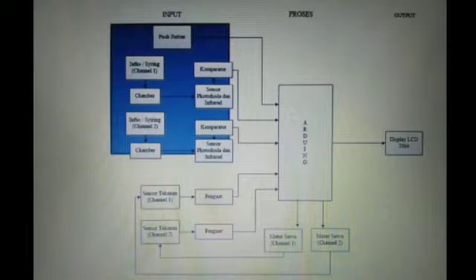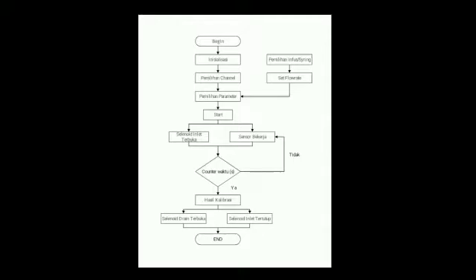The output of the photodiode and infrared will enter the comparator circuit and compare the input voltage with the reference voltage. Then the ADC will change the analog data and it is processed by the microcontroller on Arduino. Then the LCD will display the results of the time counter, flow rate and volume according to the applicable formula.